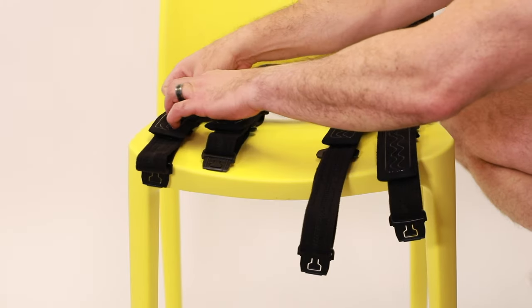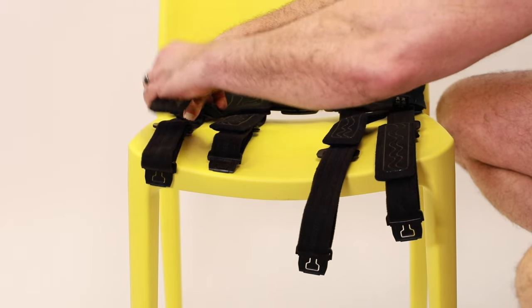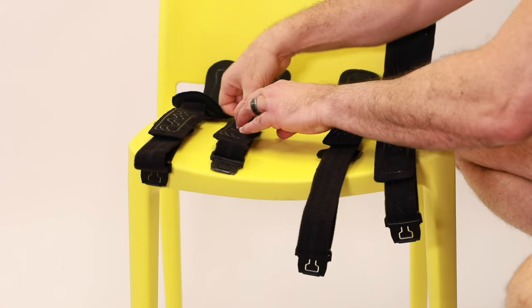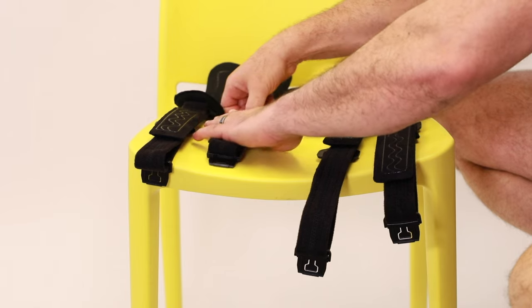Once properly fitted, unbuckle the straps and lay the brace out. Make sure to note the placement of the anti-migration pads. Simply unfasten the velcro holding the pads to the strap and straighten them in line with the strap.